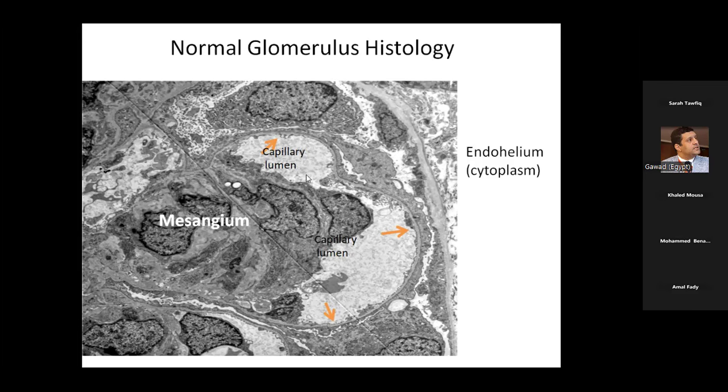But when I knew that this is the same compartment, I found the idea of endocapillary proliferation. Why in endocapillary proliferation do I find mesangial proliferation, like in post-infectious GN? Because it's just one and the same compartment.